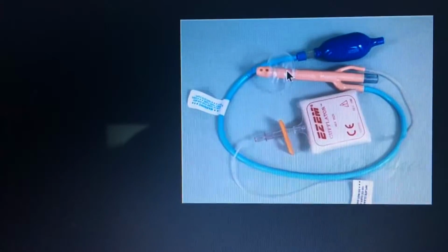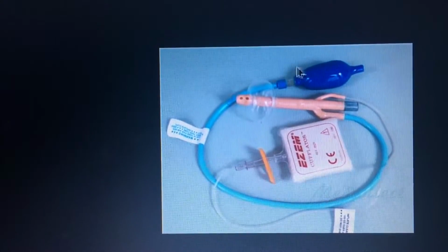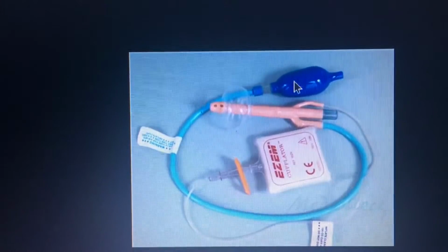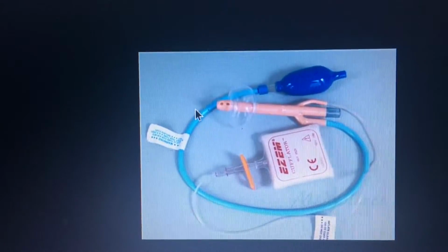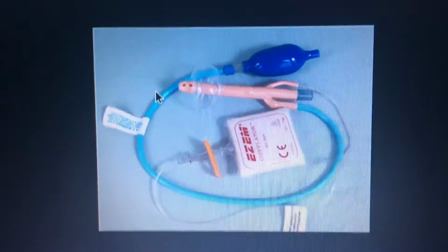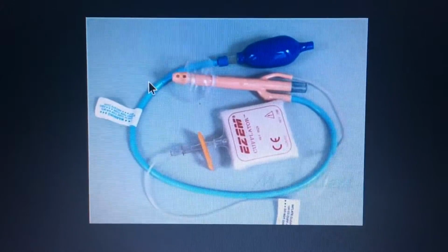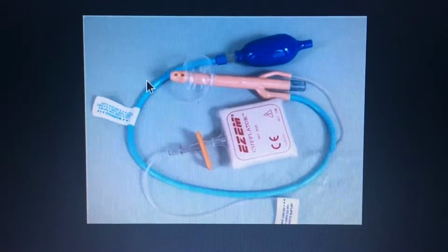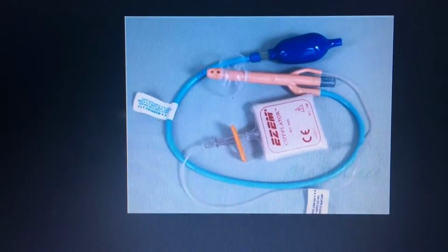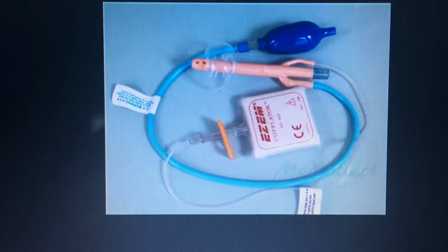I told him that we'd be inserting this tip, inflating this balloon once it was in there to anchor it down by applying 1 squeeze of air, and then once the radiologist was in, the radiologist would further pump more air using this bulb into the rectum to dilate the large intestine so that we can use it as a double contrast exam, so that we can see all of the intestine. We also instructed the patient that we'll be retrofilling the colon with barium. So we had the patient change into a gown and removed any metal from the body.